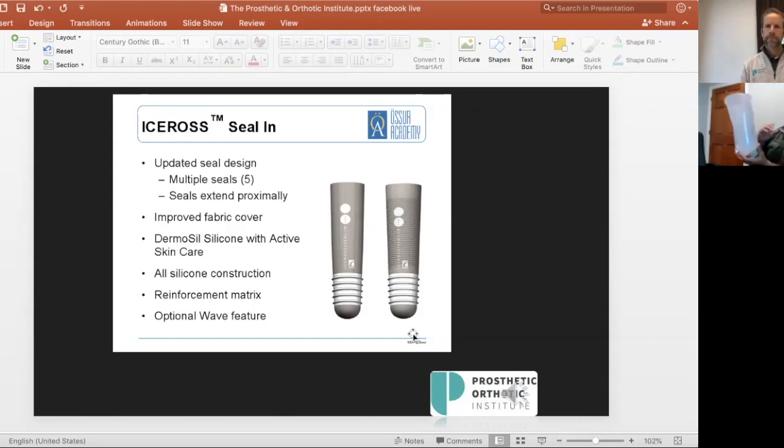There's also elevated vacuum, which we'll cover for above and below knee amputees. It can be kind of sophisticated, a little more advanced for above knee amputees. Works really well because, again, we're trying to create that environment where proprioceptive feedback is at its highest. So this system is good. I like it for new above knee amputees because we can squeeze more tissue. We can manipulate that residual limb a little easier for above knee amputees. I don't like to use this type of suction system for below knee amputees unless they have a nice bulbous limb, again, like we talked about earlier, or a lot of tissue. So someone with very low body fat, for example, and they're a below knee new amputee, active 20-year-old, for example.